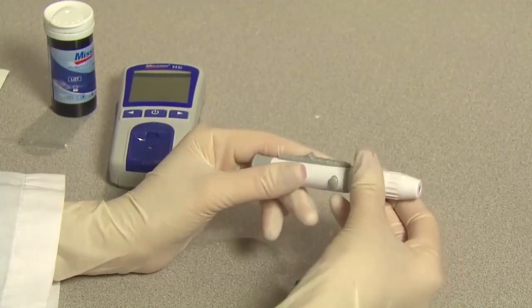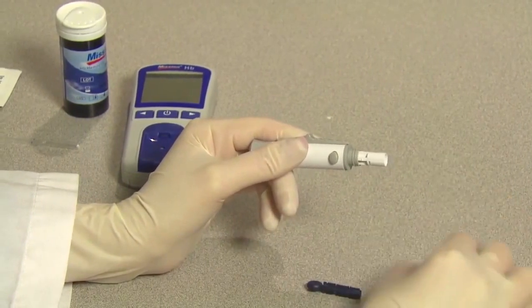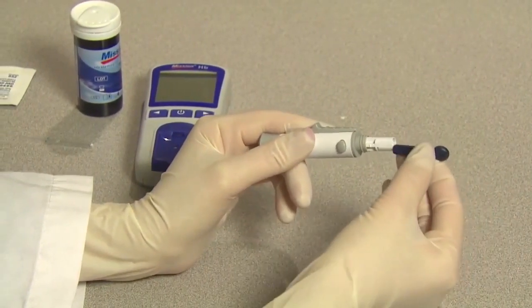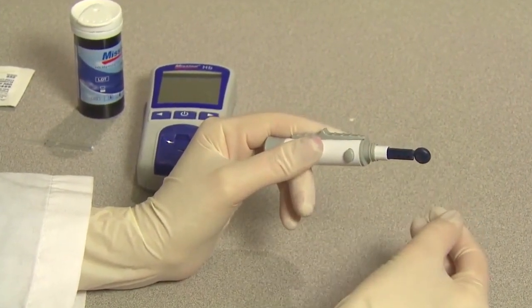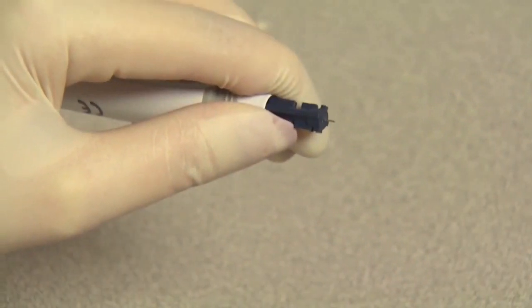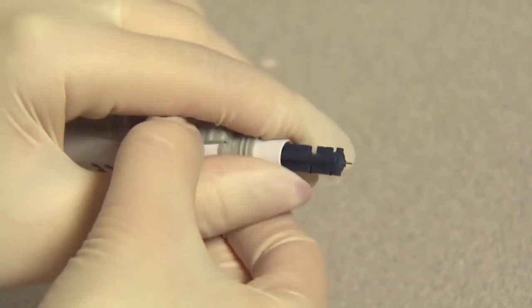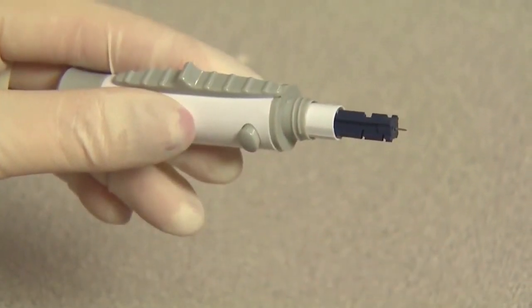Unscrew the lancing device cover from the body of the lancing device. Insert a sterile lancet into the lancet holder and push it until the lancet comes to a complete stop in the lancet holder. Hold the lancet firmly in the lancet holder and twist the safety tab of the lancet until it loosens. Then, pull the safety tab off of the lancet.